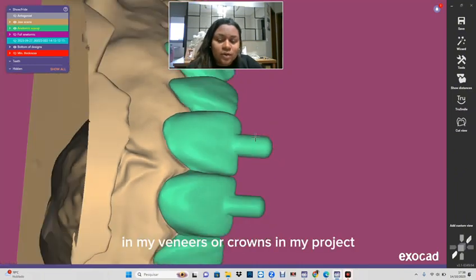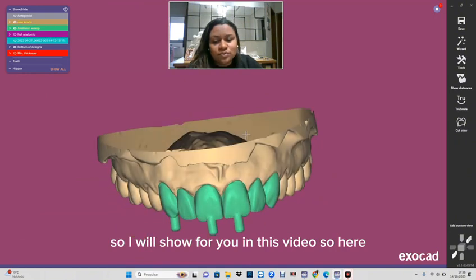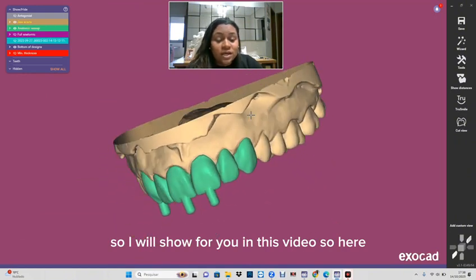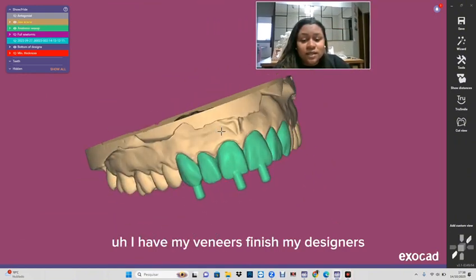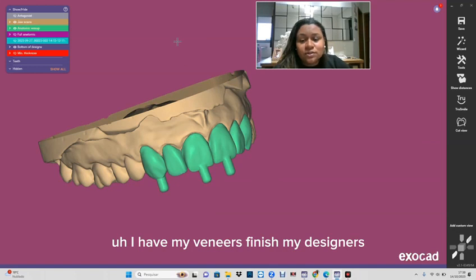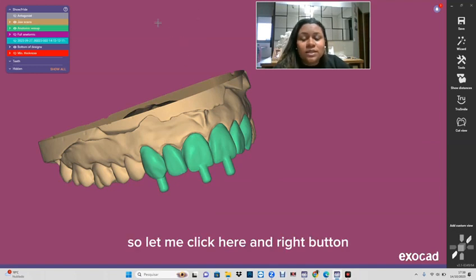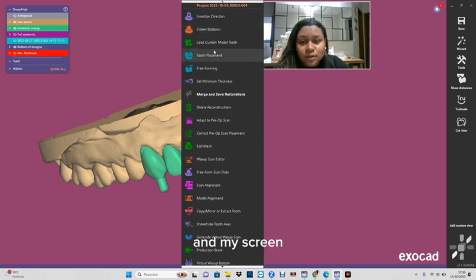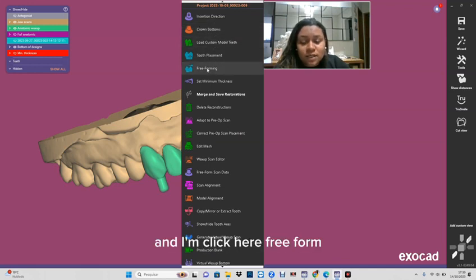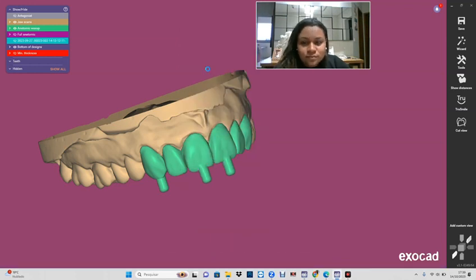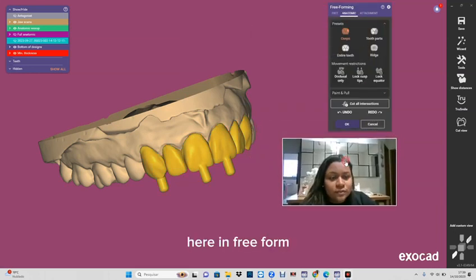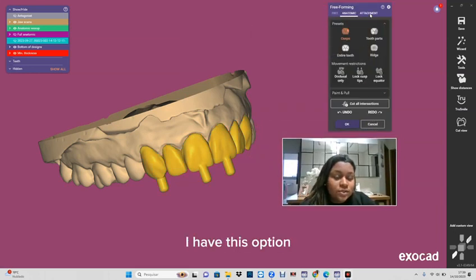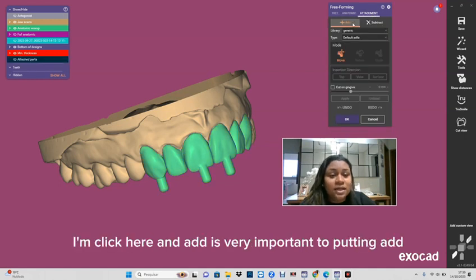Here I have my veneers finished in my design. So let me click here and right button on my screen, and I'm clicking here in free form. Here in free form I have this option in the attachment tab. I'm clicking here.